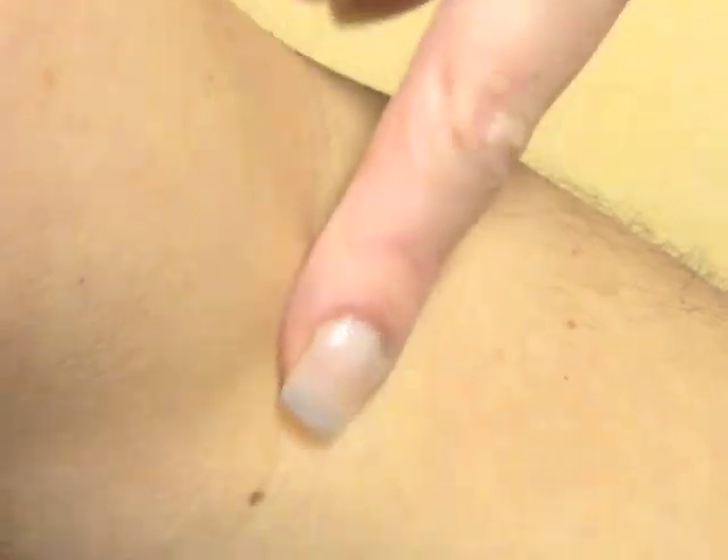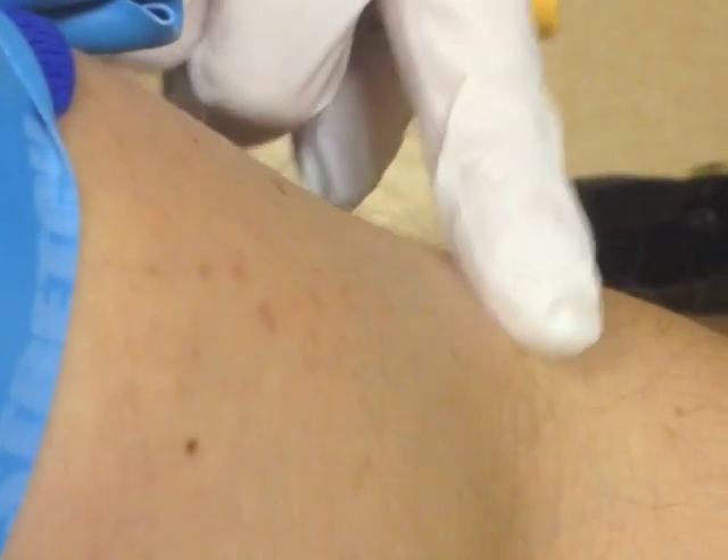That's my cubital fossa there — that's my arm. Just finding a vein; it's a bit cold outside this morning so it's probably tricky to find. But once one lifts, it's pretty easy with a tourniquet on there — just a venous tourniquet.